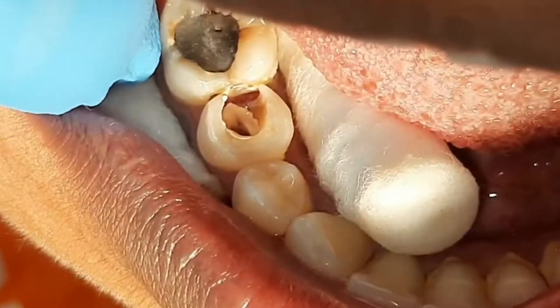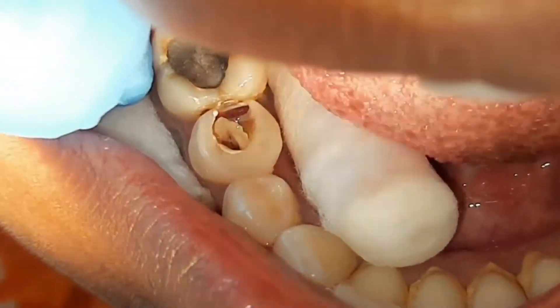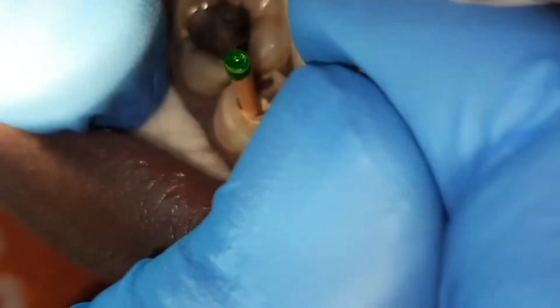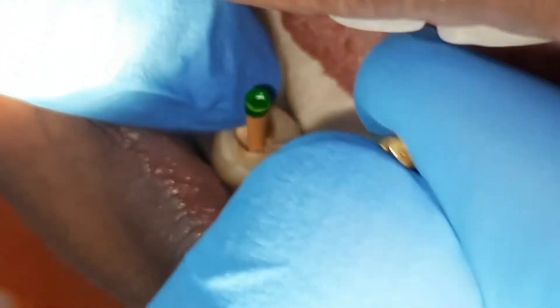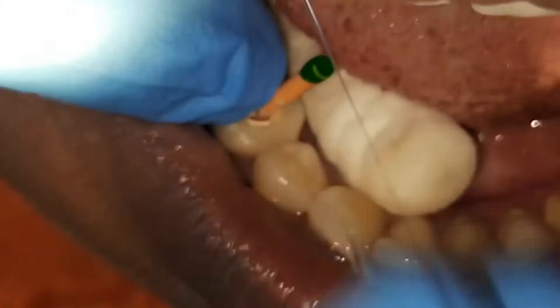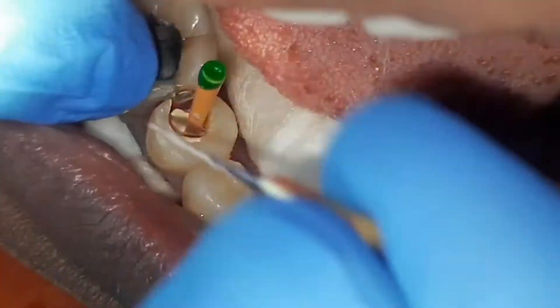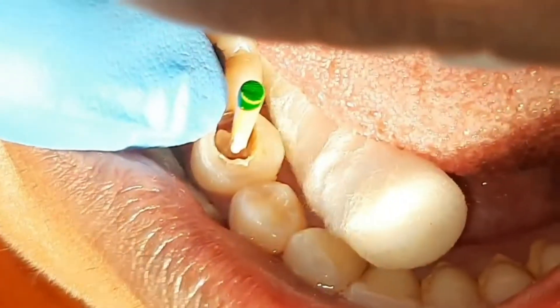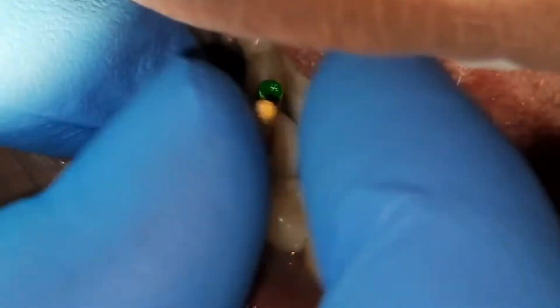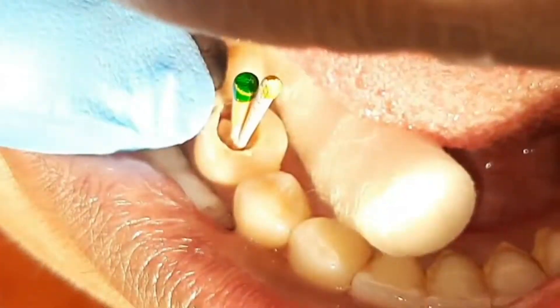With the help of a spreader, apply medicament-based root canal sealer, spreading it side to side in the canal. After that, the D11 spreader is pushed apically as far as possible, condensing the master cone side to side. The space created is then filled by the extra cone.